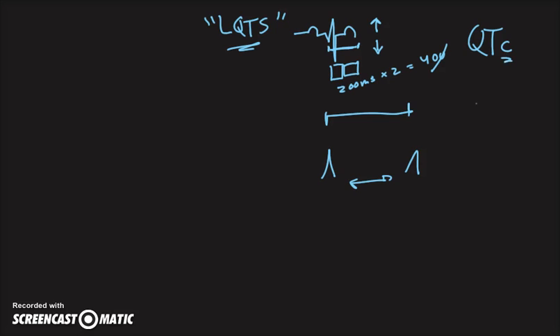The corrected QTc, you can use any med calculator. Usually people use apps on their phones. But if you wanted to be academic about it, there's multiple equations you can use, and there's controversy over when to use what. If someone's heartbeat is between 60 to 100, which is a pretty normal range, we can use an equation, I forget whose name it was, which is QT length over the root of the RR distance.